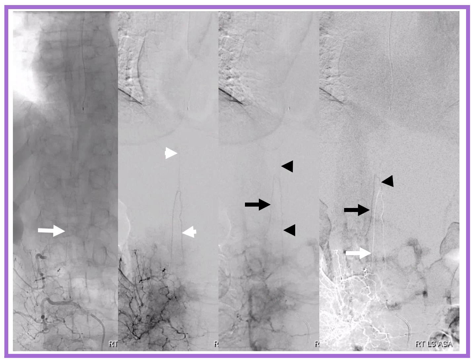So here's a low mag injection. We see on the left image the white arrow pointing to the radiculomedullary artery. White arrow heads are pointing to the anterior spinal artery. That's coming up to, maybe, the T11 segment at the most. From above T11, you have competing inflow from a yet unidentified source to the anterior spinal axis.